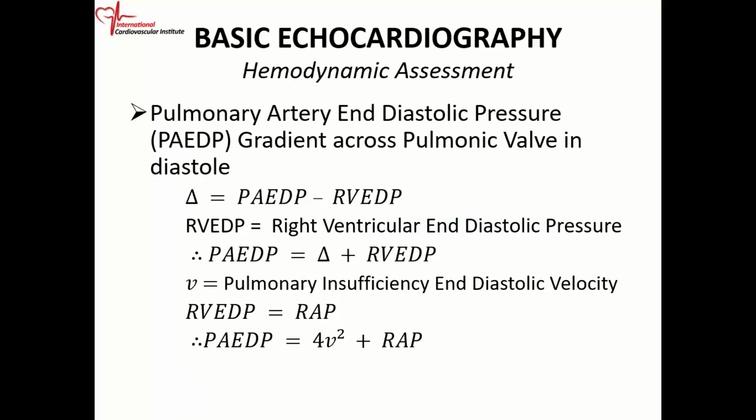What about the PA diastolic pressure? When you go to the ICU and they ask you about the pulmonary pressures, you're not only reporting the pulmonary artery systolic pressure, but you have to report on the pulmonary artery diastolic pressure. Now, if we're going to do some thinking, because hemodynamics is just really thinking, a little deeper thinking.